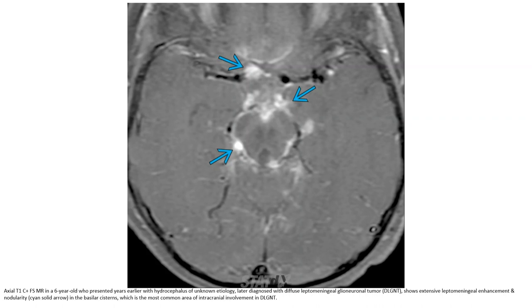This is a T1C+ fat-saturated MRI in a six-year-old who presented six years earlier with hydrocephalus of unknown etiology, with a diagnosis of diffuse leptomeningeal glioneuronal tumor. There is extensive leptomeningeal enhancement and nodularity in the basal cisterns, which is the most common area of intracranial involvement in diffuse leptomeningeal glioneuronal tumor.